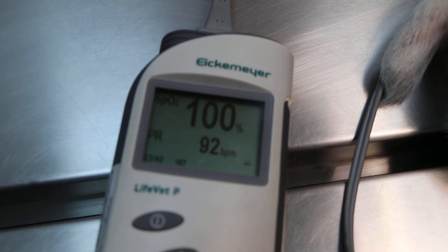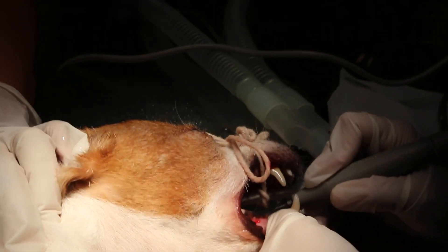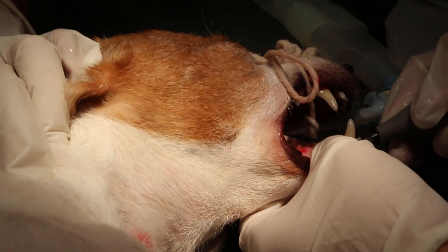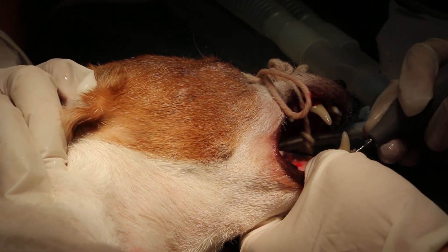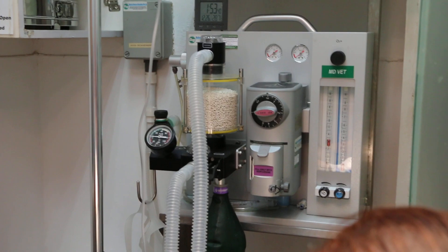Normally, what's the normal pulse rate? It's a normal dose. Okay, so I have to stop now. And that's how we do dental scaling in an old dog — minimum sedation, mainly isoflurane gas, and monitoring with cardiac and pulse oximeter.